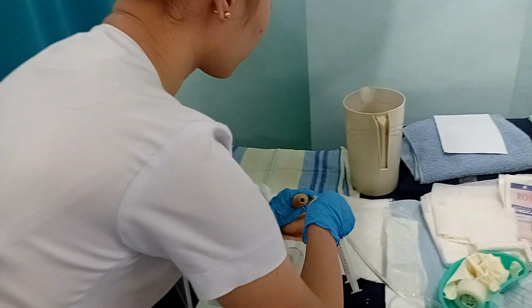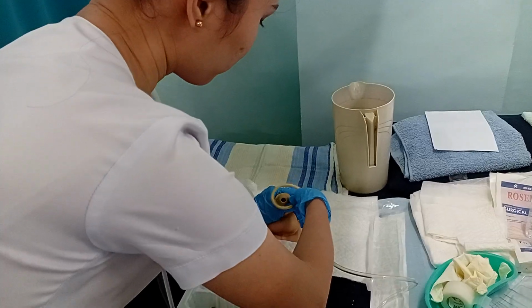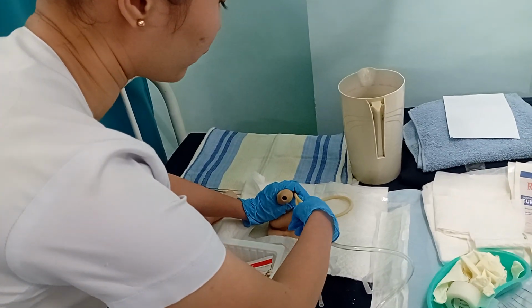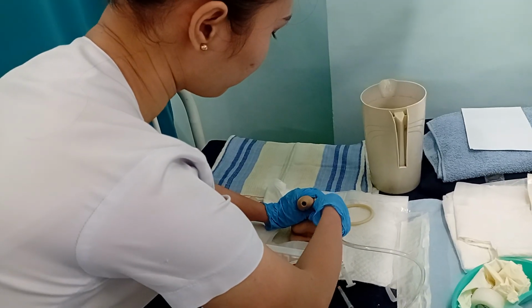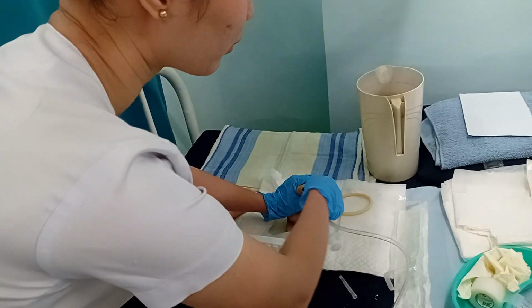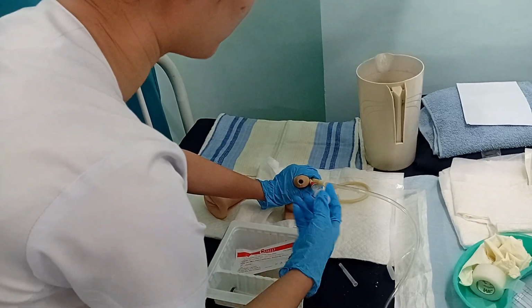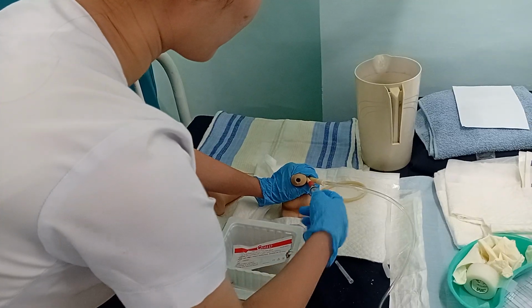Okay, you observe that there is backflow of urine, and now you will continue to insert up to where? Up to the bifurcation. Okay, insert up to the bifurcation. Once you reach the bifurcation, what will you do? We're going to inflate the balloon. Okay, inflate the balloon.